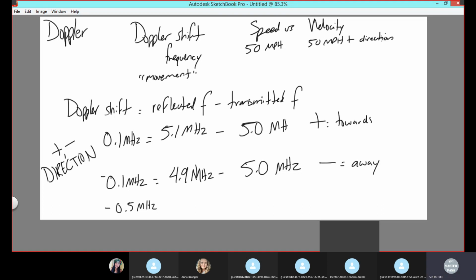If you look at color, that color already implies a direction, either towards you or away from you. If you look at your spectral wave, if you see the wave above the baseline, that's a direction, it's towards you. If you see a spectral wave below the baseline, that's away from you, that's also a direction. So anytime you use Doppler, it automatically gives you some sort of speed, how fast something is going, but at the same time, it gives you a direction. So the moment that happens, they call it a velocity. Okay, so velocity is simply the addition of the direction, which we always see in Doppler.